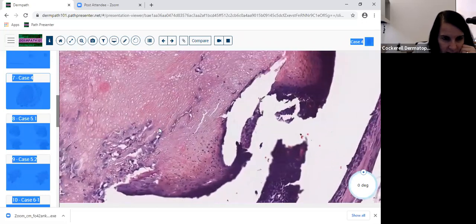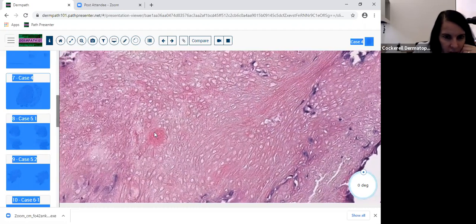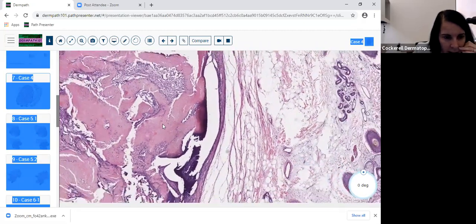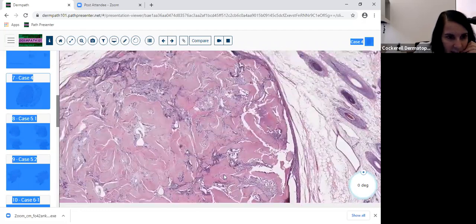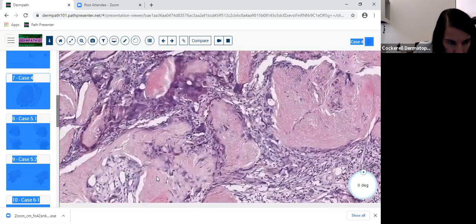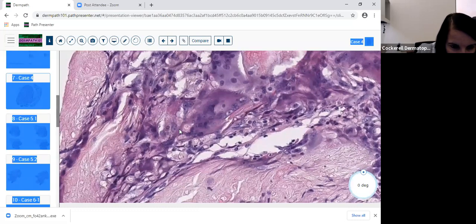And then you see these cells in this area where there are no nuclei. They're very clear. The nucleus is lost or missing. Your so-called shadow and ghost cells. And you just say, yippee, I've got it. It's a pilomatricoma, calcifying epithelioma of Malherbe. You don't see much calcification here. And then you look into these areas for multinucleated giant cells, and you see them right away. And you say, hey, this is a ruptured one.